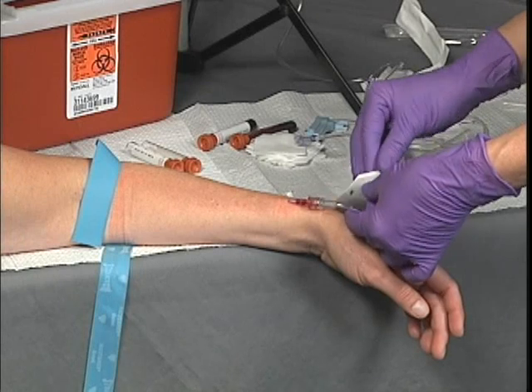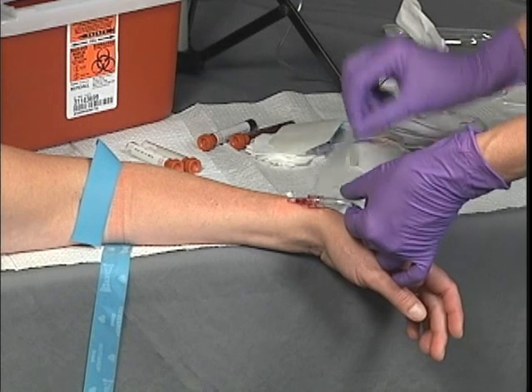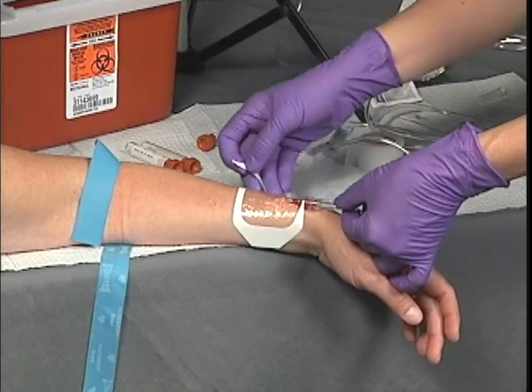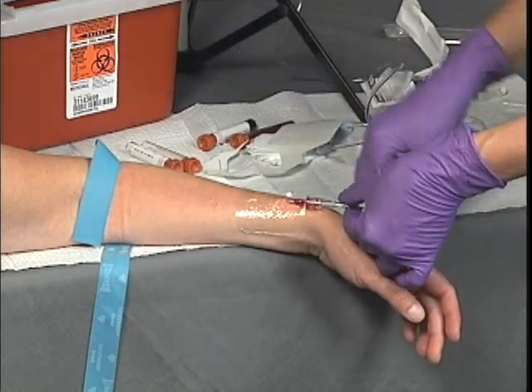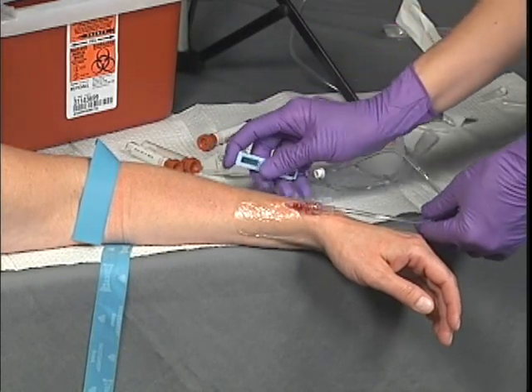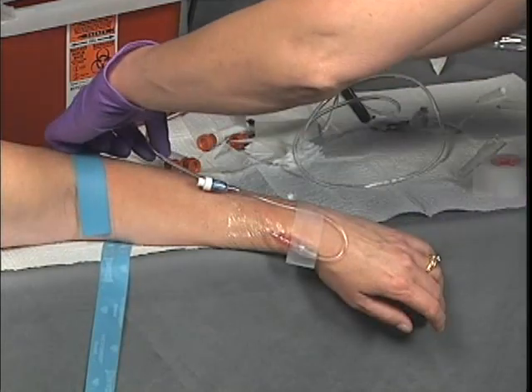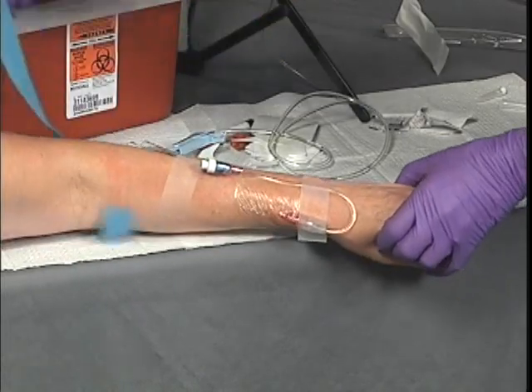With the IV running and before securing the IV catheter in place, inspect the venipuncture site for signs of infiltration. If the IV is observed to flow properly, wipe away any fluid or blood so that tape will adhere sufficiently. Secure the IV and the IV tubing in place, then cover the insertion site with a sterile dressing or commercially available device. Adjust the flow rate to the appropriate setting and continue to monitor the patient for signs of fluid overload or other complications resulting from the IV.